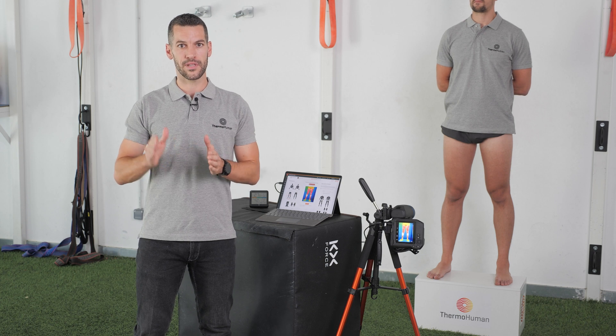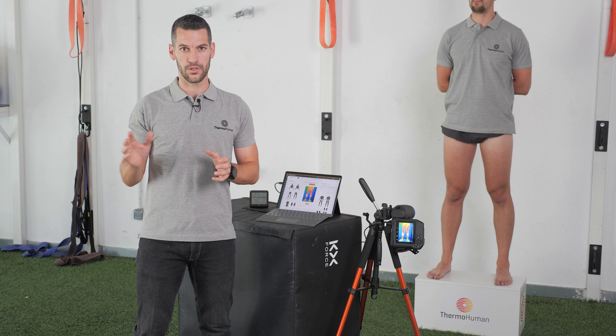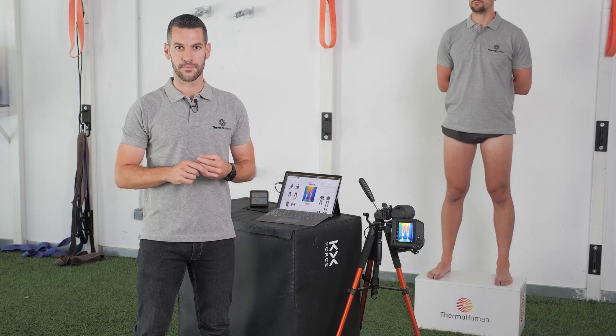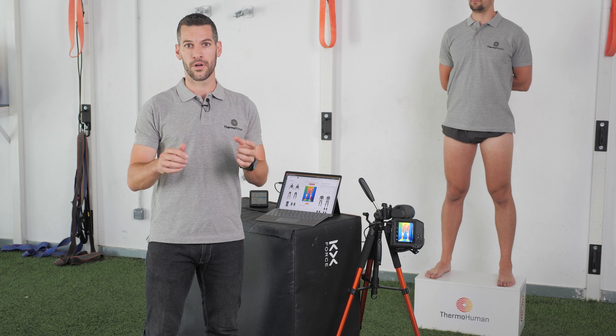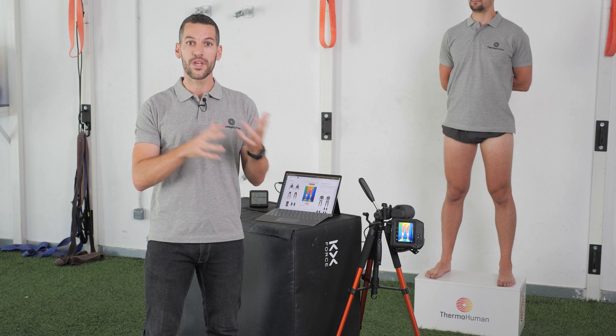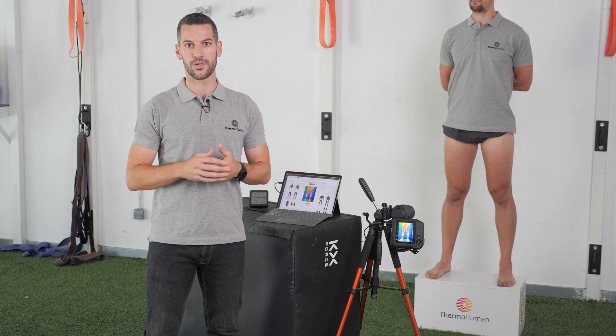At least 10 minutes after the subject comes into the facilities, we make sure external conditions are acclimatized. We strongly recommend combining the data collection with other tests, such as a weighing routine, wellness surveys, or other tests. We do so because we want to analyze the subject under neutral conditions — that means before the training session starts, and before the use of any cream, ice or massage on the skin that might influence skin temperature.